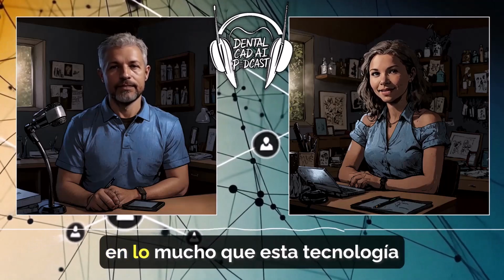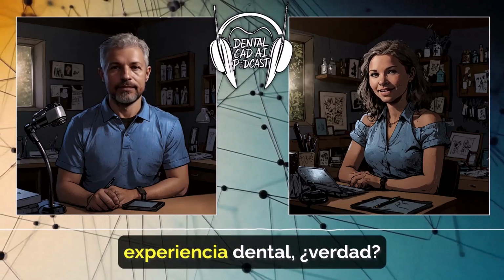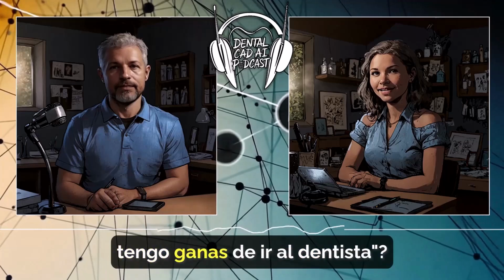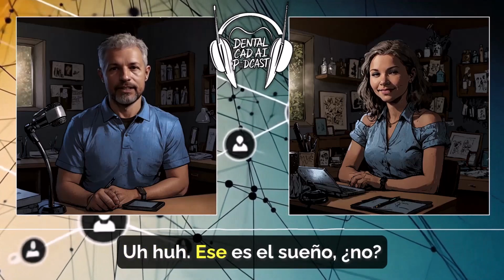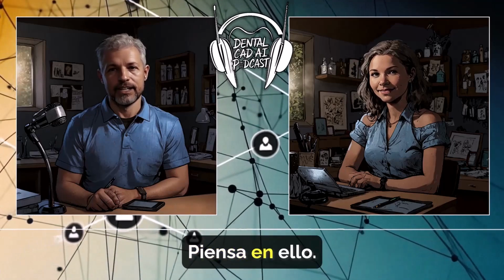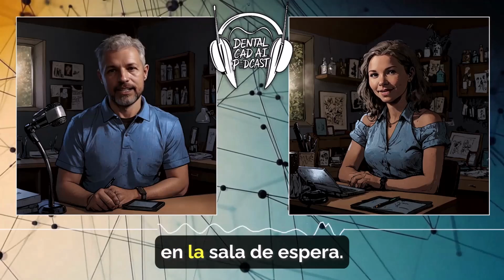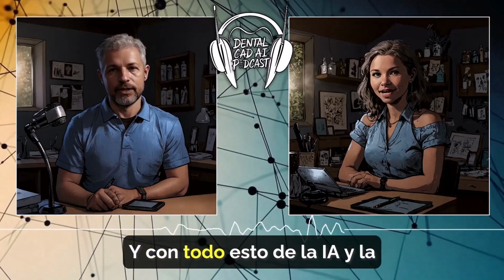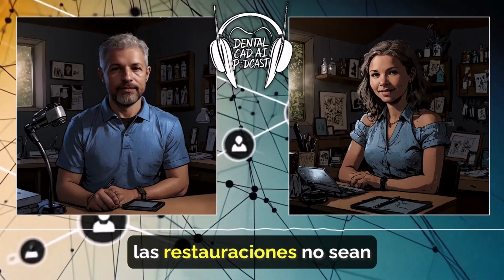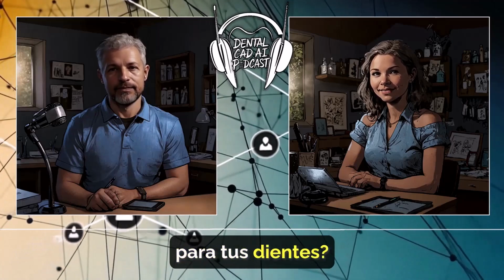It's really kind of mind-blowing to think about just how much this tech could change the whole dental experience, right? Could we actually get to a point where people are like, oh yeah, I'm looking forward to going to the dentist? Seriously, that's the dream, isn't it? I think the potential is definitely there, though. Think about it. Quicker visits, less invasive procedures, maybe even less anxiety in the waiting room. Who wouldn't want that? And with all this talk about AI and personalized care, could we see a day where restorations aren't just functional, but aesthetically perfect? Like tiny little works of art for your teeth.